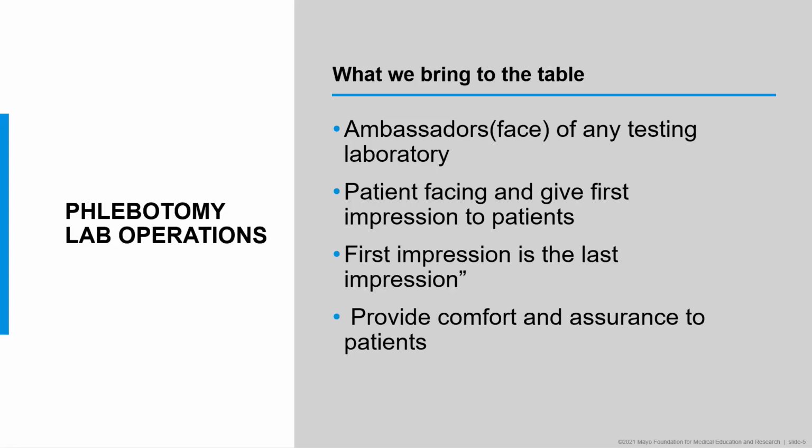We provide that face. The first time they see any provider within an institution is the phlebotomy. So we give them the first impression, and most of the time it's the last impression they get. So we want to make sure that we provide very courteous and knowledgeable service, and be kind to them when they come to our work area.